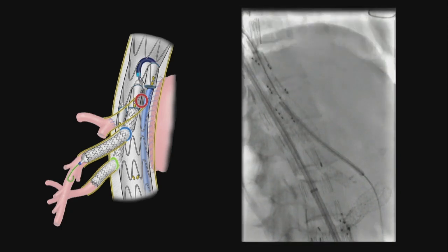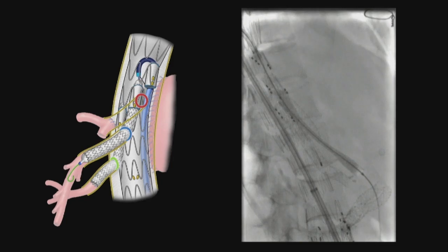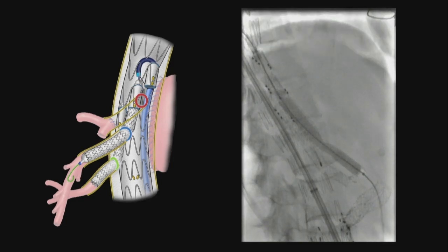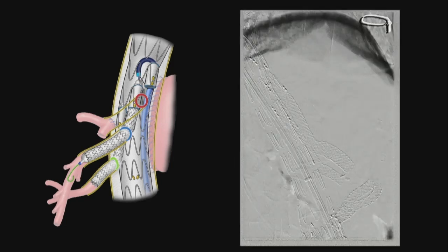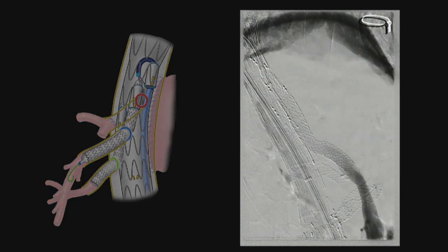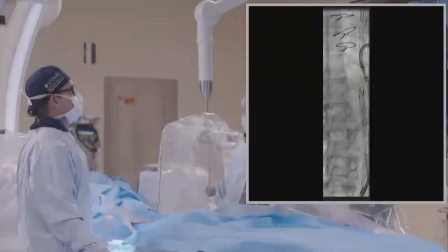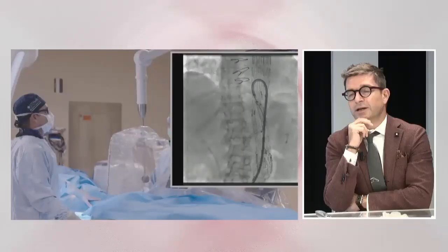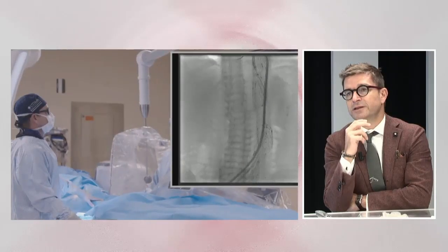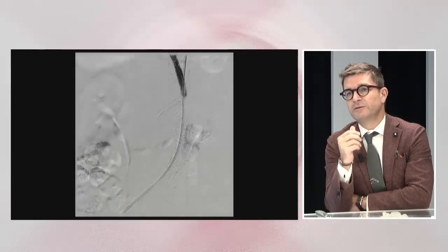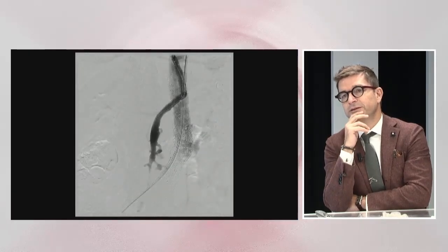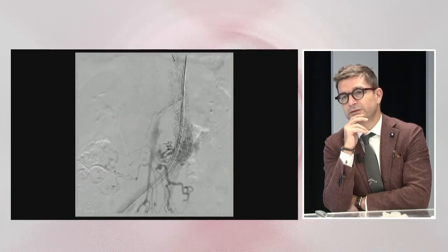This total transfemoral access has really revolutionized the way we do thoracoabdominals and is the way to go for the majority of patients — you simplify it and don't have to deal with arm access. Note how often we use lateral views in this case. The overall dose at the end was under 1 gray with all these fenestrations and branches, and most branches except the right renal artery were performed in lateral view. The imaging quality is outstanding without the arms in the way — and this is digital zoom, not magnification.